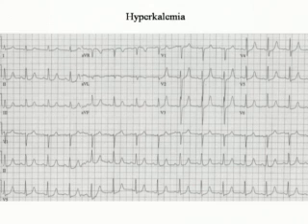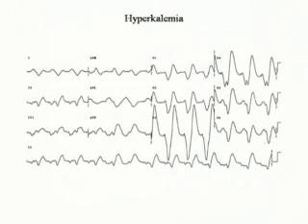But when hyperkalemia becomes very severe, you don't have that same shaped T-wave. What will happen is the P-wave amplitude will diminish, the QRS duration will tend to grow into your T-wave. So you'll get what's called a sinoventricular rhythm. The sinus node's still depolarizing, but it can't capture the atrium. But the message can still get down the specialized conduction system and get to the ventricle, where depolarization is really messed up. So we get a QRS, the best example is shown here. Our QRS goes out and merges into our T-wave, giving us an appearance that's often termed a sine wave QRS.